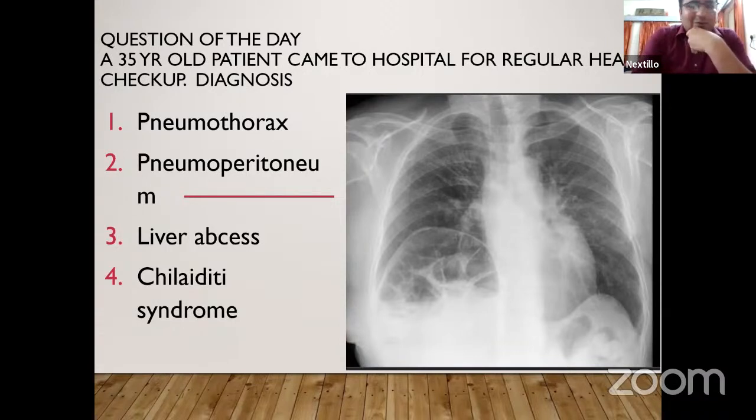Just think about it. What is happening out here? We have to go how you always do. We are going to look for the bones. We are going to look for the parenchyma. Okay, there is something out here. What is happening out here? This is the right hemidiaphragm. Okay, this is the right hemidiaphragm. Is it air under the diaphragm?